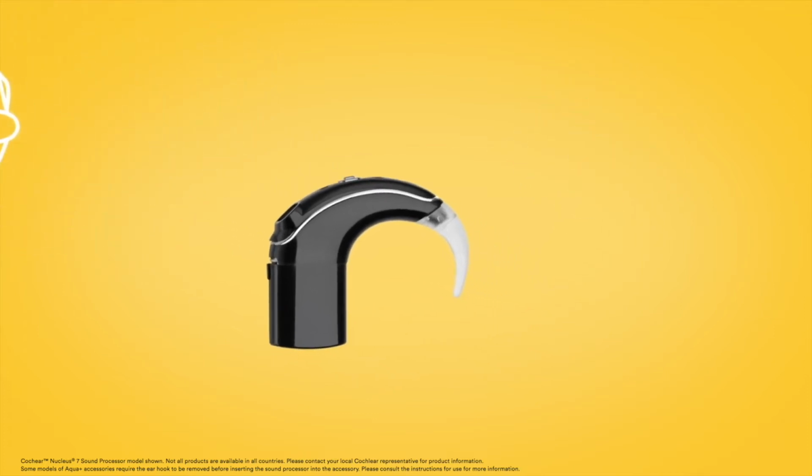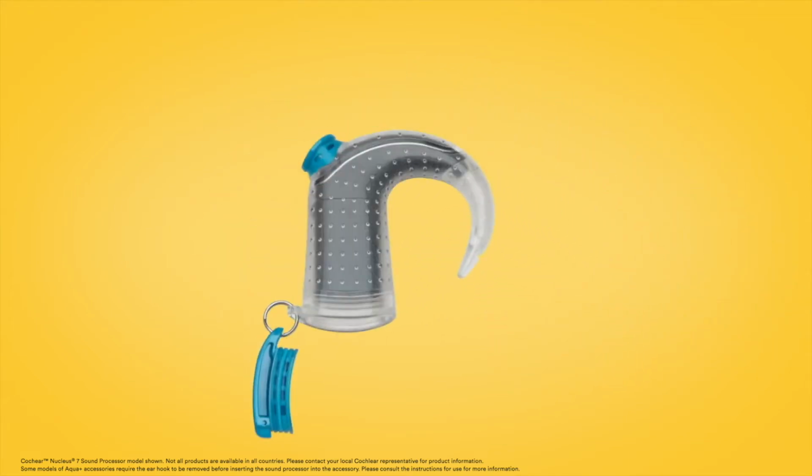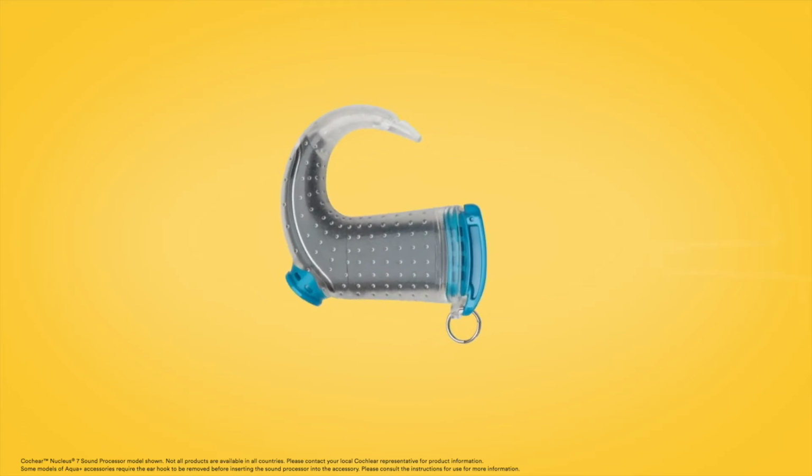Next, leaving your ear hook on, insert your Nucleus 7 sound processor into Aqua Plus. Be careful to avoid bending the ear hook or detaching it from the sound processor. Once your sound processor is inside, insert the plug into the base of Aqua Plus. To make a good seal, push the plug in as far as it will go.